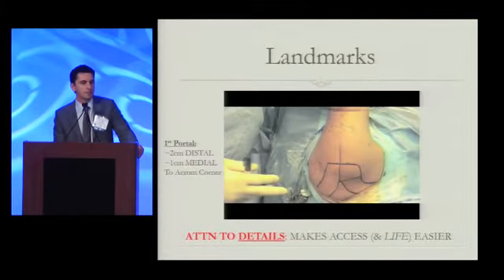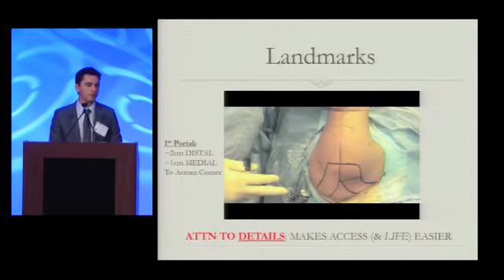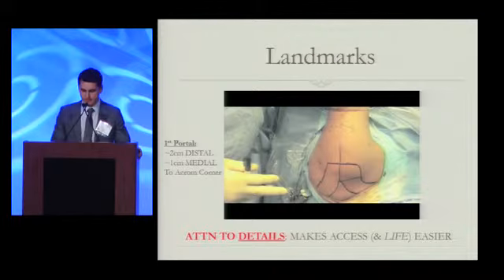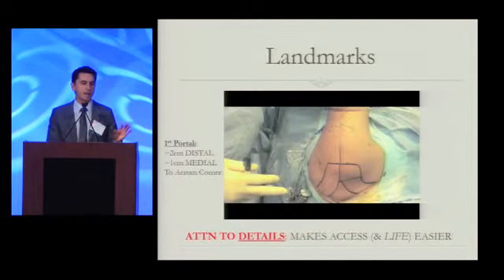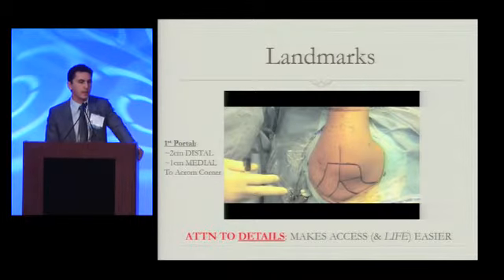So the first portal is going to be approximately 2 centimeters distal and 1 centimeter medial to the acromial corner. Attention to details make a big difference. Properly marking the skin of the acromion is going to be a very important thing to do so that we know exactly where we're going to start. Now, people's anatomy externally is quite different, so it's a good starting point to mark your surface anatomy, but it doesn't make your portals completely accurate.